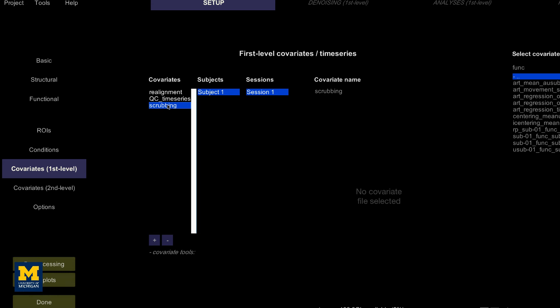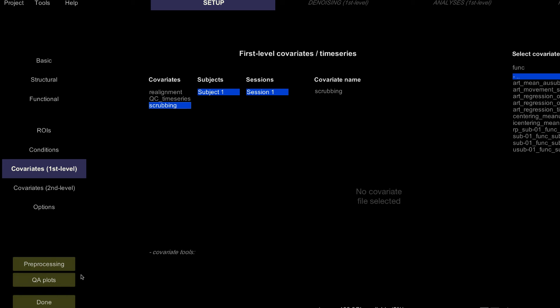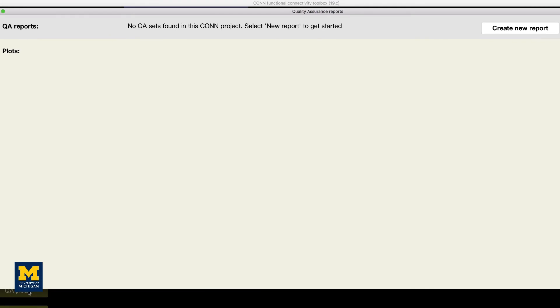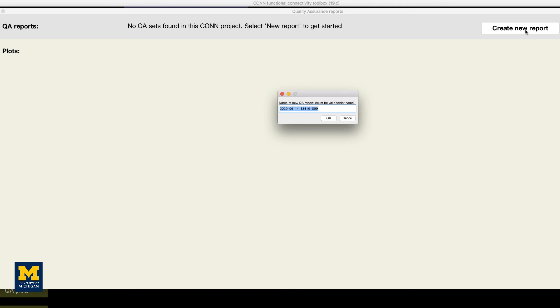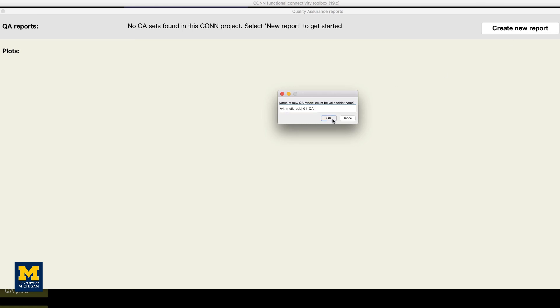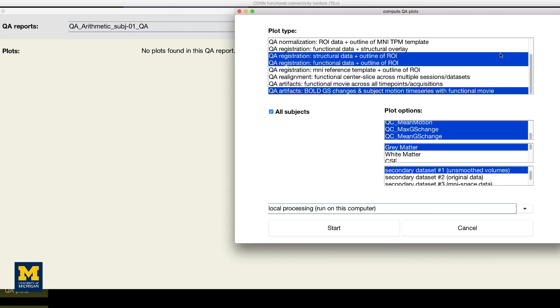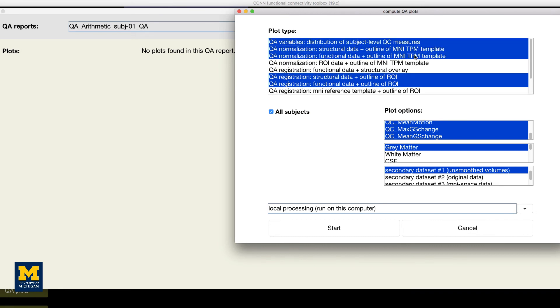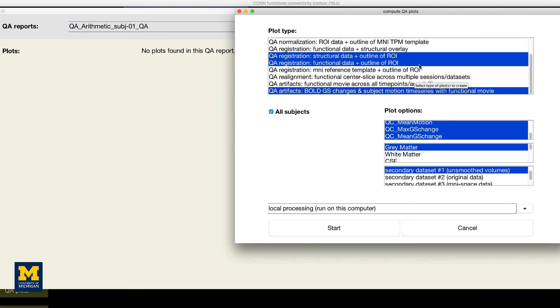You can summarize all the QA checks that we did above by clicking on the QA plots option in the bottom left corner of the CONN GUI. In the window that opens up, click create new report and label it whatever you want. Then click create new plot and select any of the QA checks that you want to include in your report. The default ones that are highlighted will display checks such as the functional and structural data on the MNI template and the motion parameters. When you have chosen all of the QA plots that you want, click start.